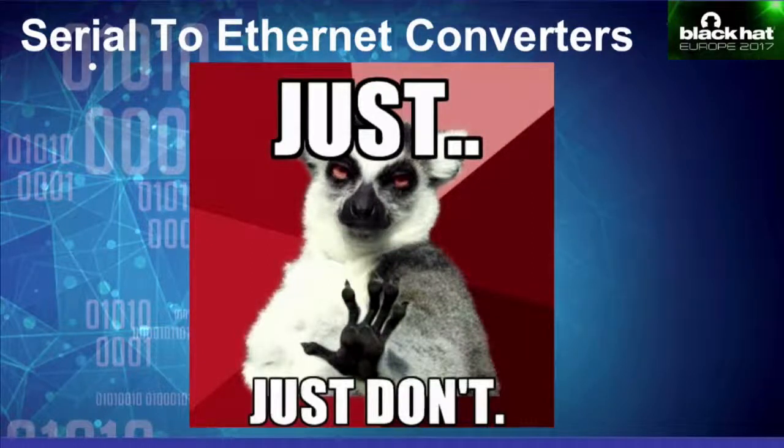So some of you might remember that in 2015 there was a large attack on Ukraine's electrical infrastructure. There was an unscheduled power outage. And again, as per the Department of Homeland Security, the attackers were able to remotely corrupt the firmware of one of these serial to Ethernet converters, which caused the outage. So generally it's always a bad idea to use these devices, and if you really must, just make sure that you secure and lock down the whole infrastructure.